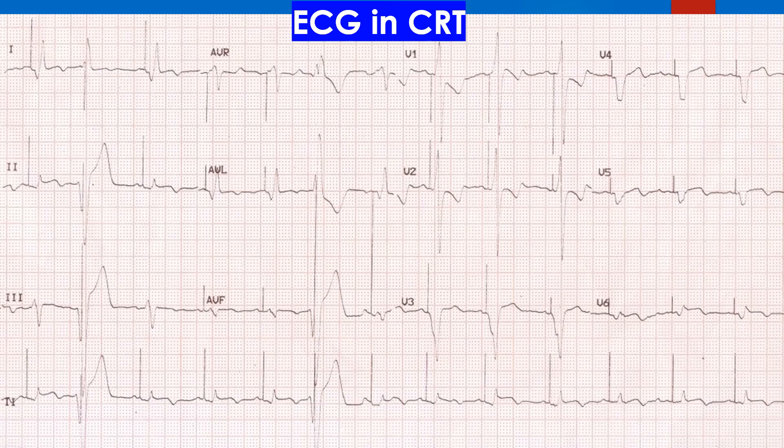In complexes 1 and 3 in lead 1 of the current ECG, the pattern is suggestive of RV pacing. The presence of R in V1 indicates that there is definitely a contribution from left ventricular pacing. Complex 2 looks like an ectopic beat over which a pacing artefact is superimposed. Though it may appear to be a pseudo fusion, it is more likely to be safety pacing in CRTD.